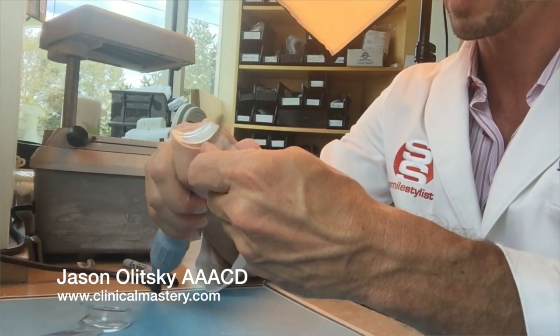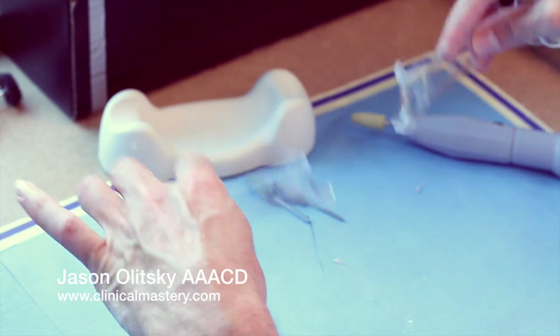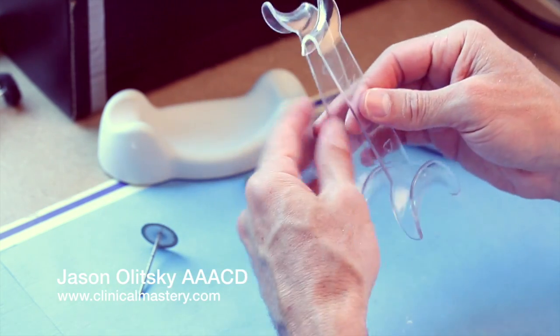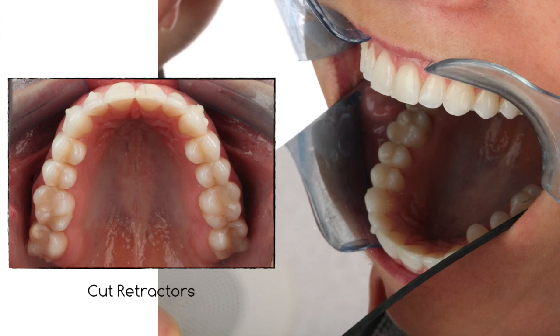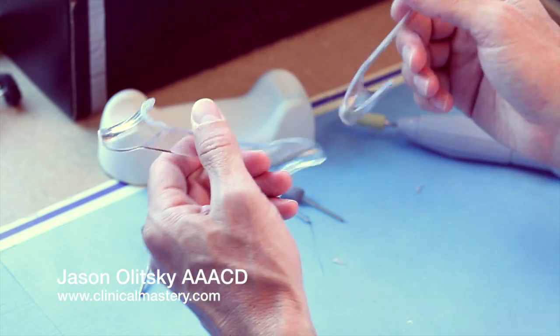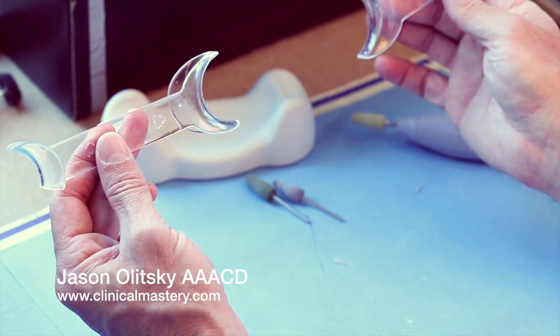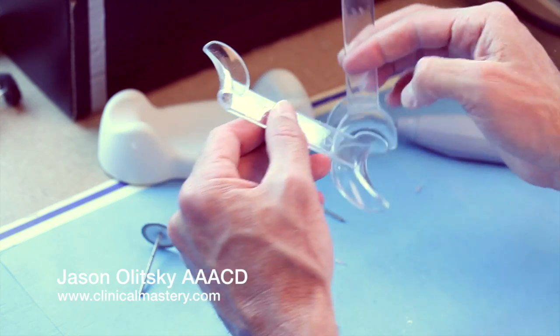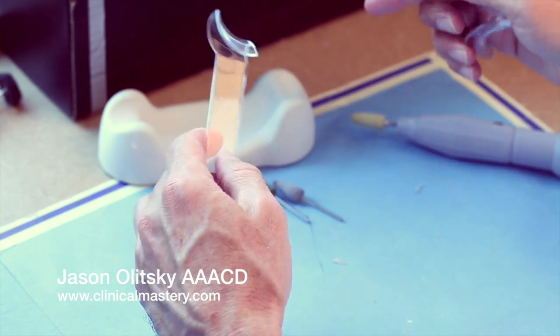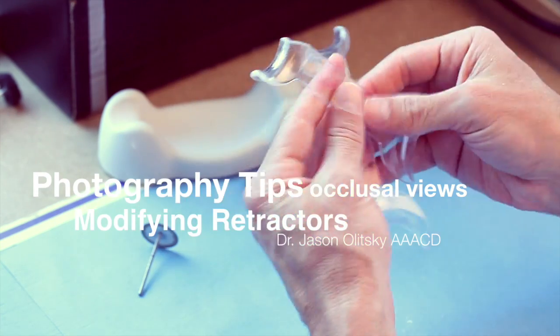Two retractors done. They'll hold the upper or lower lip out of the way without the mirror being in the way, so you get the most ideal occlusal view. I cut universal retractors so that in one pack you have retraction for the alternate views — maxillary and mandibular teeth, frontal and lateral views — and then you can just flip it around to the cut side to get your occlusal views, all with one retractor.